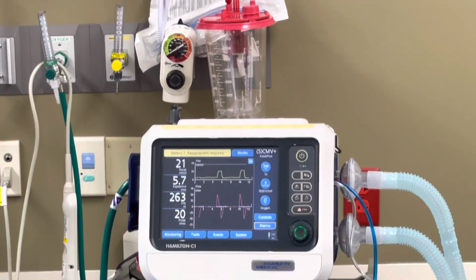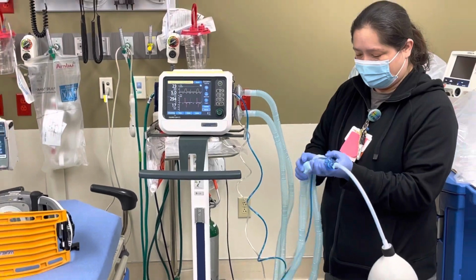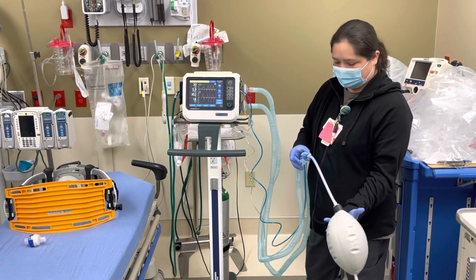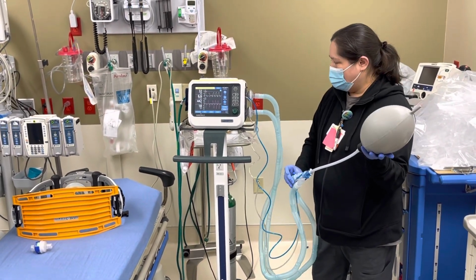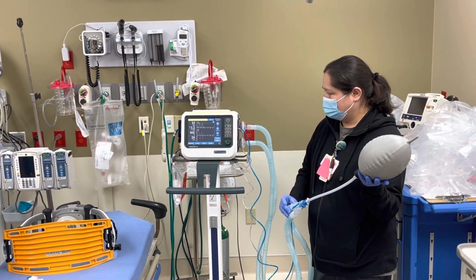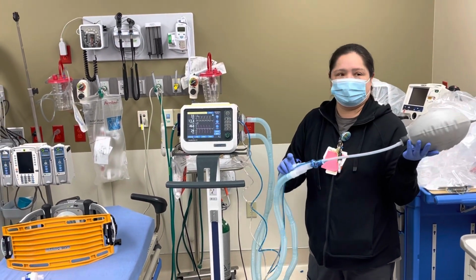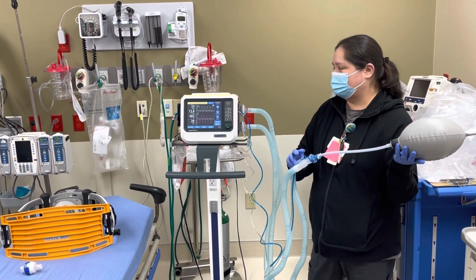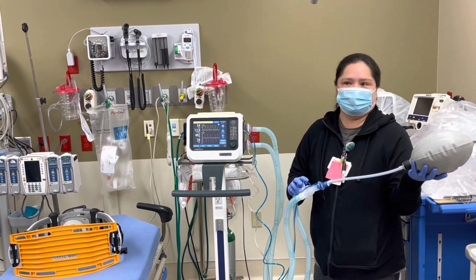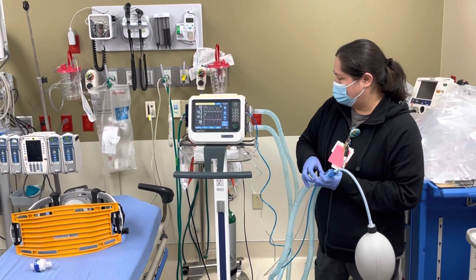Another thing is sometimes things get disconnected. Sometimes there'll be a leak. This one is one of my favorite ones. It loves to disconnect. Let's see if it's going to do it. Oh, it's not going to do it. I might have it set too high. But normally, once you start hearing anything, or once you start to get a leak, on a patient it's a little different. Right now, on my perfect lung, it's not really doing anything because my lung just keeps expanding, basically. But that will be one leak that will happen. Sorry, that didn't do anything.